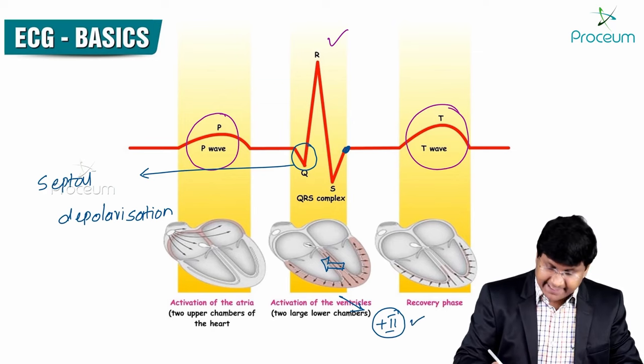In the same way, for example, we will take an ECG with a speed on the lesser side. Now, suppose you take an ECG paper with a speed of 12.5 millimeters per second. When the speed of the paper is 12.5 millimeters per second, it appears that the individual is having tachycardia. You see, this is the ECG of some different patient. It is not the same patient I showed you previously. The heart rate in this ECG paper is around 150 per minute. So now the concept is that if the paper is moving fast out of the ECG machine, it appears that there is bradycardia. If the paper is moving slowly out of the ECG machine, it appears that there is tachycardia. That is what you need to know about the ECG paper speed.